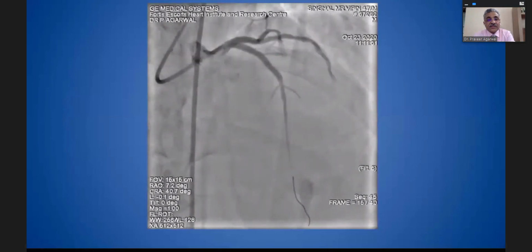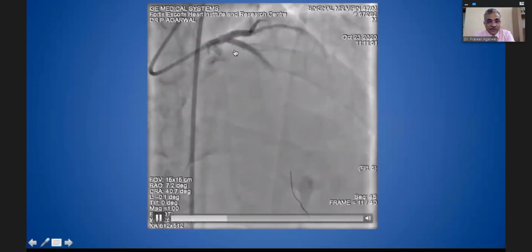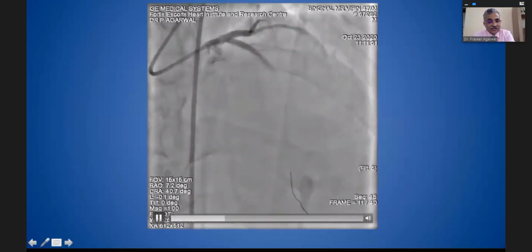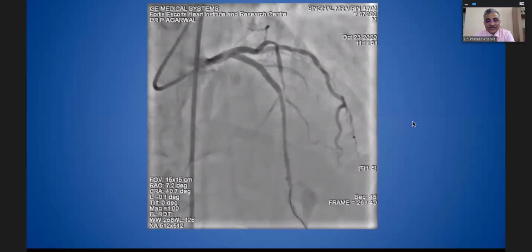And it's clearly shown on the OCT, the length. Why we noticed that is, the stent placement was here. And we could see the stent is coming to the ostium. He said, look, we did not place the stent in the ostium. Why is the stent at the ostium? So that was the reason we noticed that the stent got elongated from 26 to 29.5.